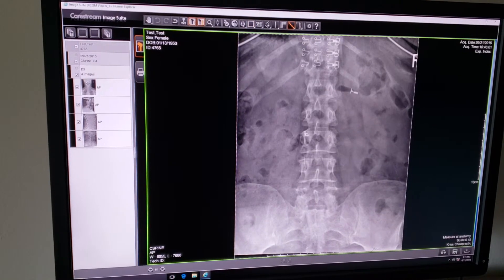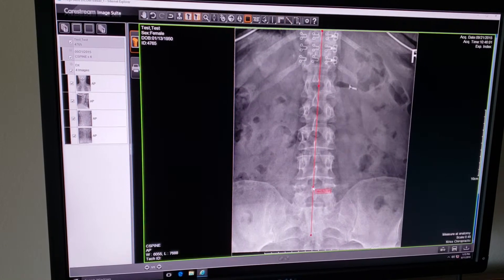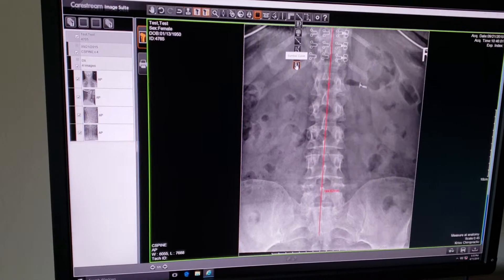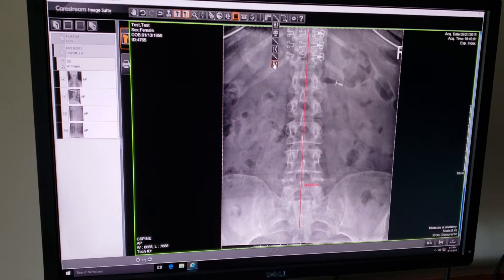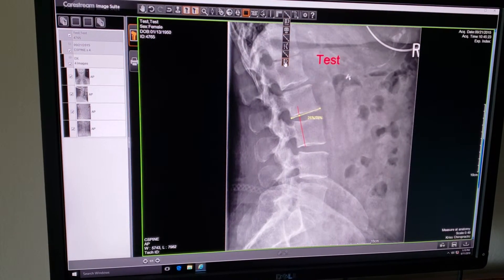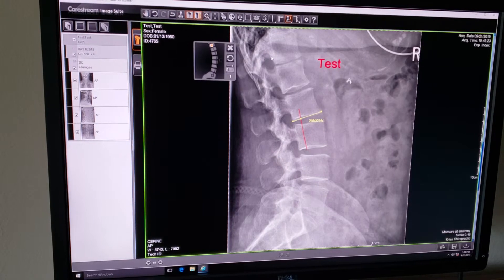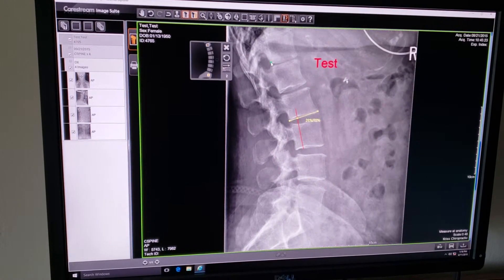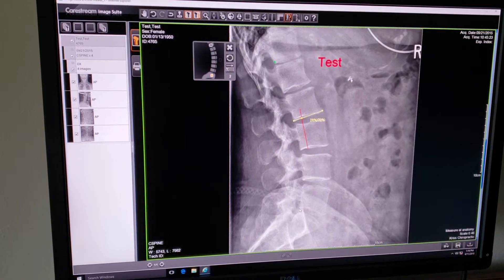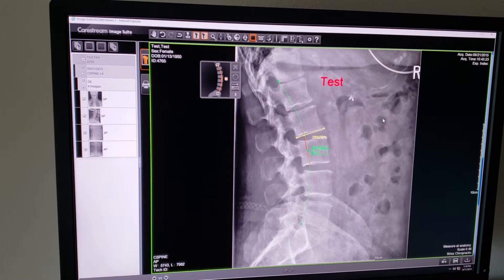Next, we have just an extended line — left click, hold, and drag to extend a line. Last but not least, we have the lumbar curve. In the same fashion as the lateral cervical curve, you can show a normal lumbar curve on the lateral lumbar x-ray: posterior superior of T12, posterior inferior of L5, and then click which way the patient was facing. There's a normal lumbar curve.